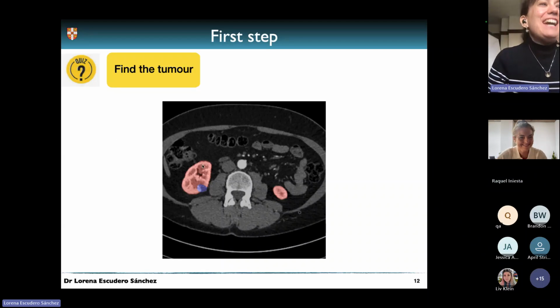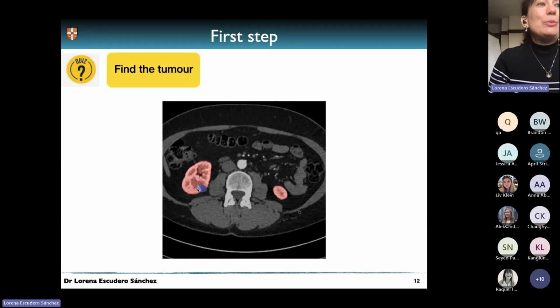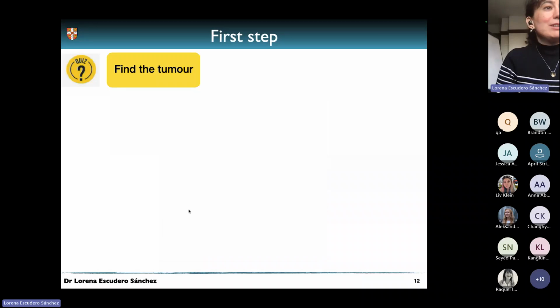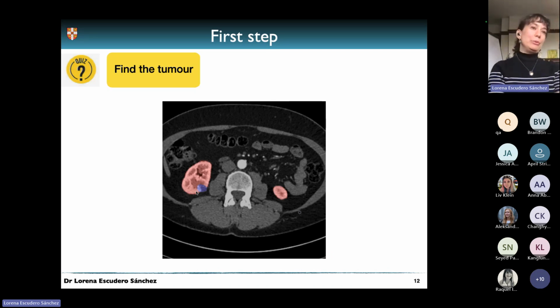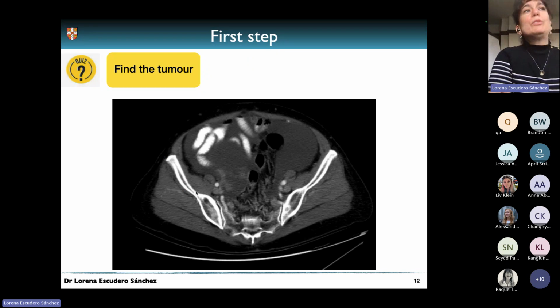Yeah, so here we have a tumor that is in the right kidney that is presented visually on the left side. So in red is the two kidneys and in blue, that's the tumor. So if I can go back, you could see something here, right? So this is something that maybe visually we would be able to understand or have a sense of what it is. But if we move to ovarian cancer, this is a lot more difficult.